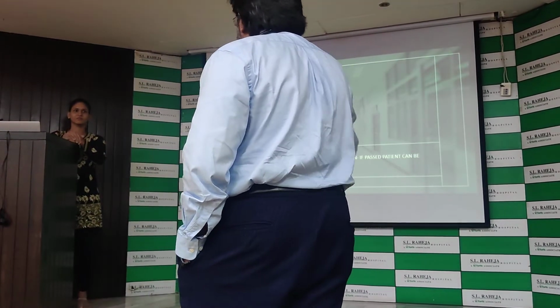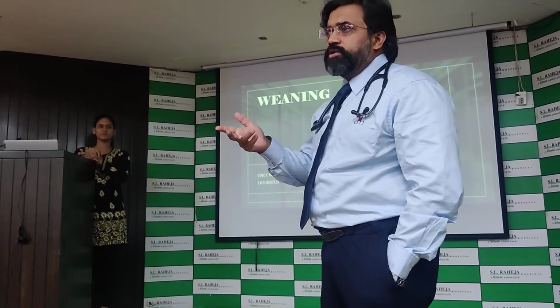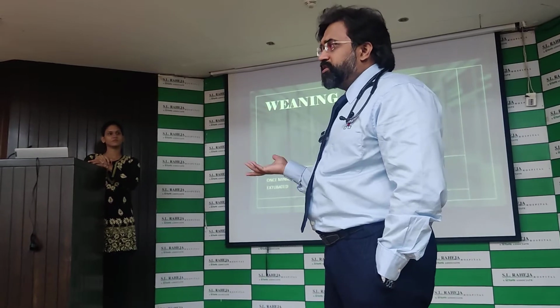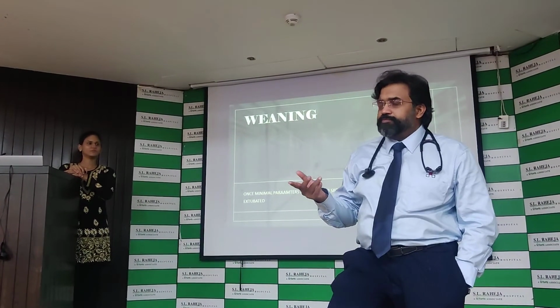You set the minute ventilation as 130%. Now you started at that, and then you forget. All you have to do is adjust the oxygenation. You just adjust the oxygenation, everything else it takes care of. So PEEP and FiO2 is all that you set. You set the PEEP and you set the FiO2.